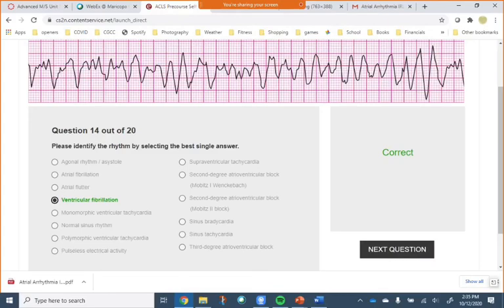And so it's VFib. This is coarse VFib, and I have a hard time between the two of these, but they want to put forth the knowledge that VTAC looks regular. It's just wide. This is not regular. There's little, there's big, there's small, there's organized, there's disorganized. It's everywhere. So it is VFib.